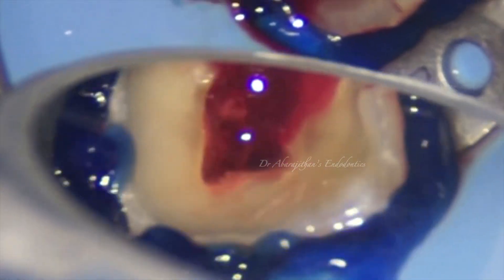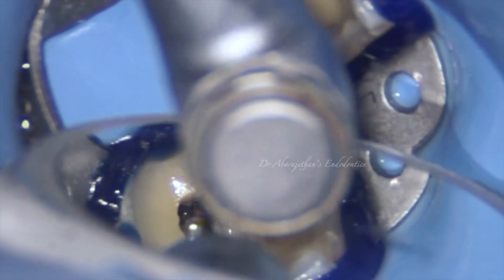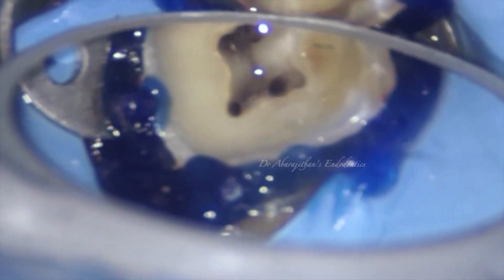This is the present and future of instrumentation, where we are slowly saying goodbye to manual glide path. In this case again we are not using any K files. The coronal enlargement is done with the orifice shaper, followed by irrigation and agitation after every rotary file usage. You can see there is another distal canal, which will also be enlarged with the orifice shaper, and then the same instrumentation sequence will be followed for all four files.